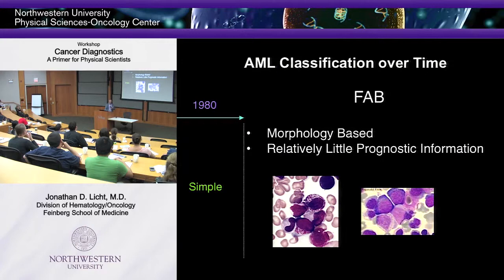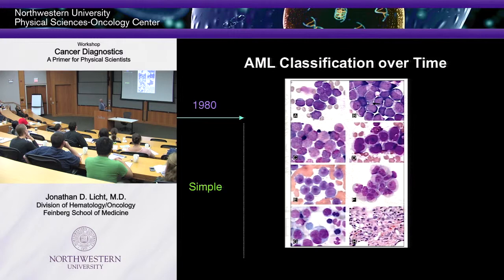This one is very large cells, not much cytoplasm. And as we go down here, we see these have these sort of pinkish granules. This is called acute promyelocytic leukemia. And over here we have megakaryocytic leukemia, where you have this very different looking cell. Over here you have erythroid leukemia. Well, this is very nice and good, and you can argue about this. We have hematopathologists who become expert at this and can make the diagnosis.